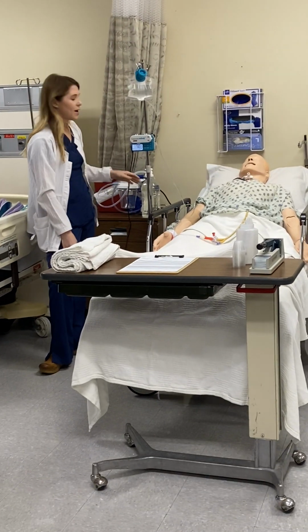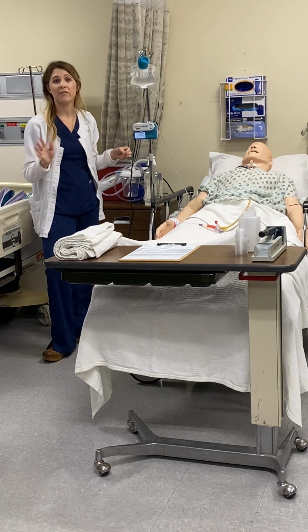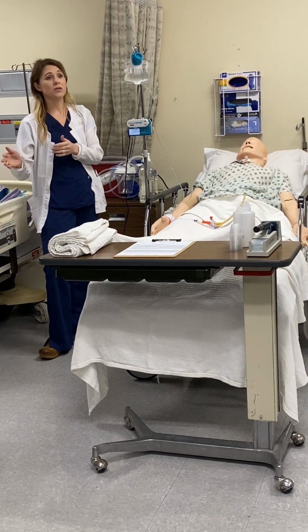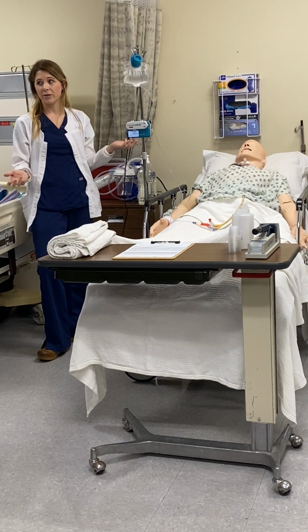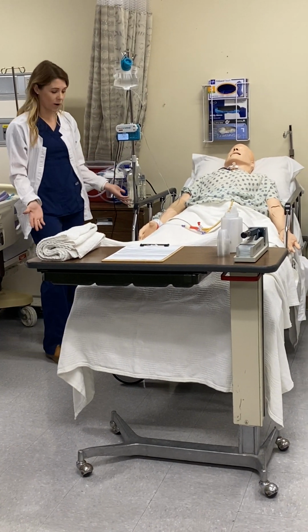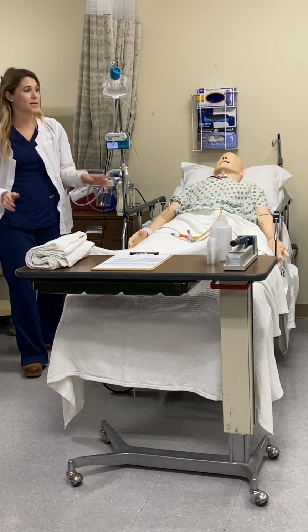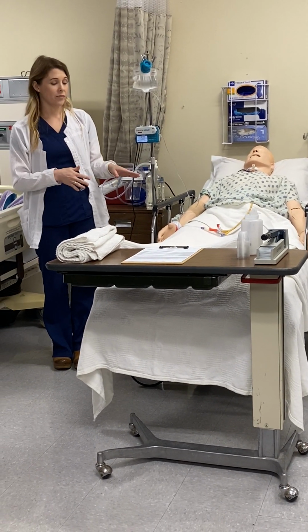ml feeding. It's all patient specific, whether they get them all night long and then they don't have any during the day, or whether they get like a bolus per feeding, like I get a breakfast, lunch, and dinner sort of thing. It all is patient specific, so I can't really tell you how it's going to be on every patient. Okay, but say this patient has this feeding running and I've got to come and give some medications. It's extremely simple. I would leave it running as I prepare my meds, so I'll do that now, and then I'll show you how I would give those meds.